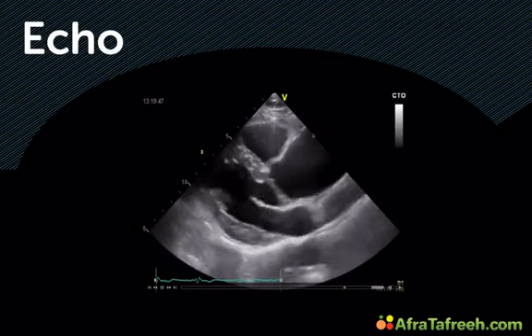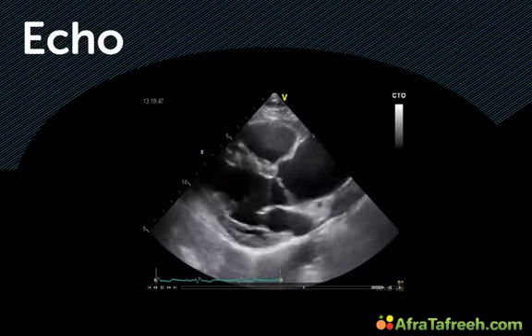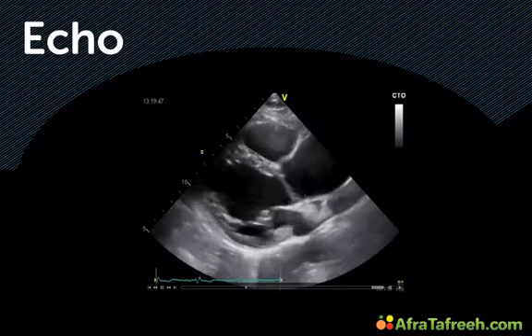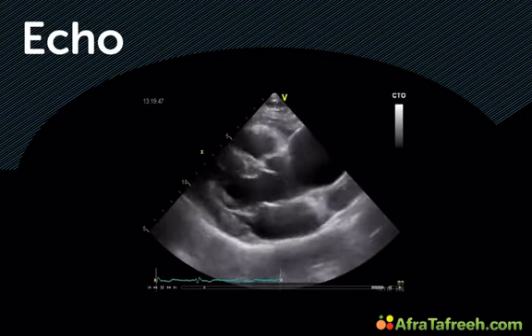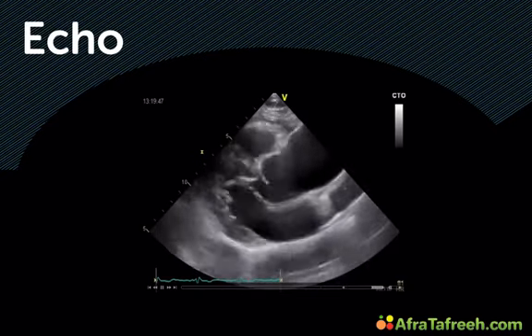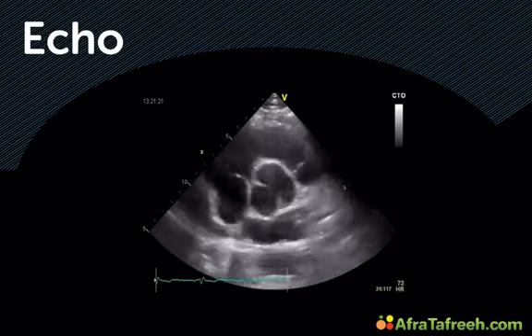What you should do in these patients is you should really try to assess all the portions of the aorta and measure it both here at the annulus, at the aortic root, at the sinotubular junction, at the ascending aorta, and also take a look at a suprasternal view to see how big the aortic arch is. So let me just go on and show you what this patient had.